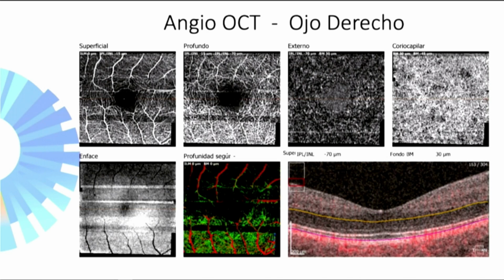Some anastomosis are projecting from the deep vascular plexus, but there are no abnormalities. On the choriocapillaris, we used to see these thickened vessels on the choroids, so we get to see some patches. These are called halos, black halos, that cause damage on the choriocapillaris.